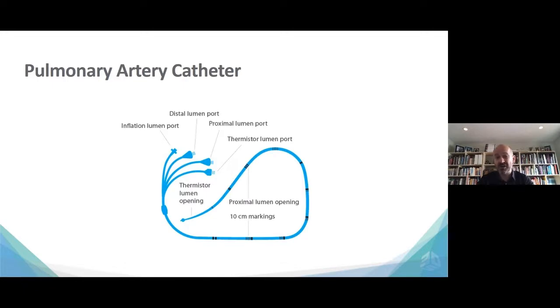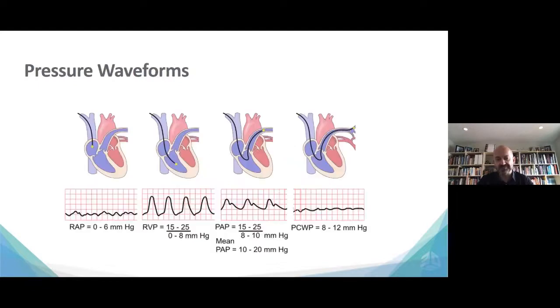And when you measure cardiac output, you need to inject through some of the proximal ports. So keep that in mind. Frequently, if you're not facile with this, you may hook up to the wrong port and you're going to get wrong measurements. So in the next picture, on the next slide, you'll see the classic tracings of the PA catheter.